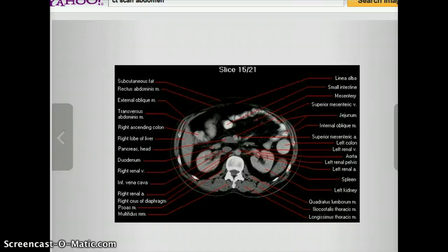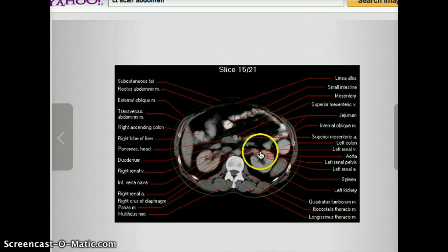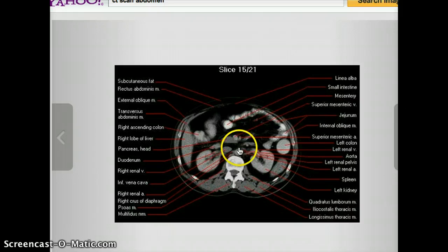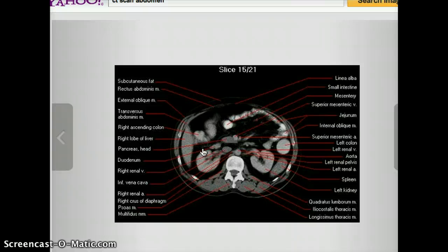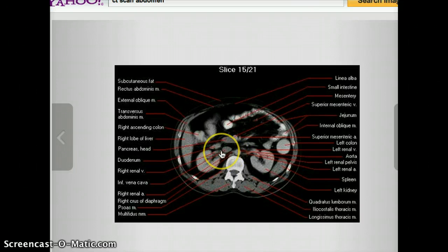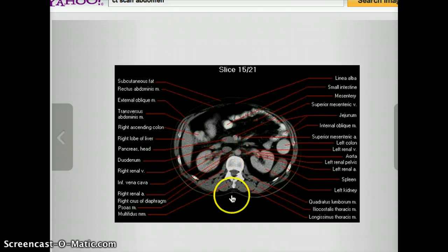Now let's look for the blood vessels by looking at the color. This looks very round, it's close to the vertebra, and these are retroperitoneal structures. You can draw a line around here — the kidneys, the aorta, the inferior vena cava are all retroperitoneal structures, including the ascending and descending colon and the duodenum second, third, and fourth portions. This is the aorta right here, and on the right side of the aorta is the inferior vena cava, which is bigger in cross section but a little flattened.